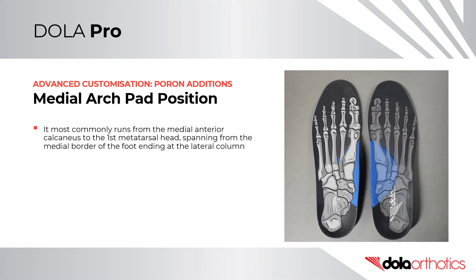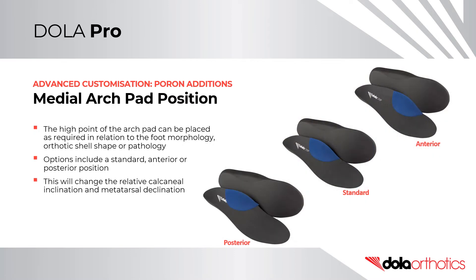For medial arch pad positioning, it most commonly runs from the medial anterior calcaneus to the first metatarsal head, spanning from the medial border of the foot and ending at the lateral column. The high point of the arch pad can be placed as required in relation to the foot morphology, orthotic shell shape, or presenting pathology. Options include a standard, anterior, or posterior position, which will change the relative calcaneal inclination or metatarsal declination.